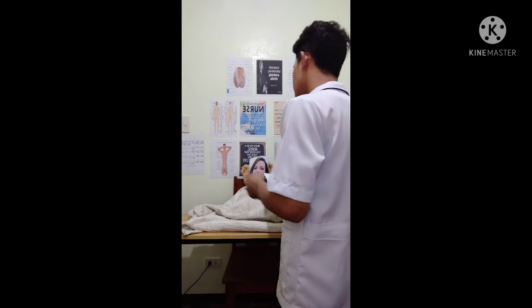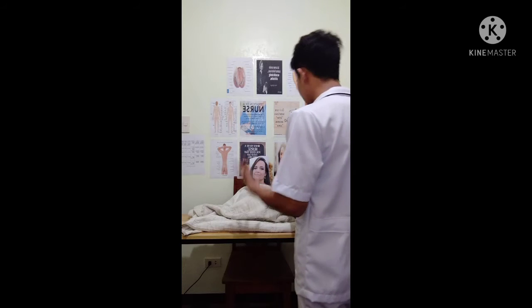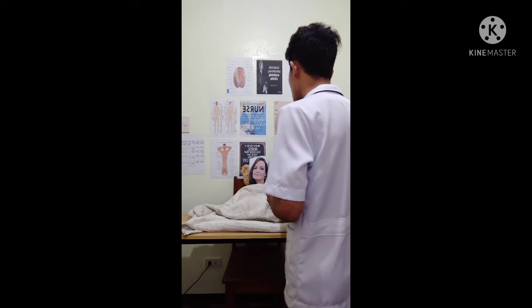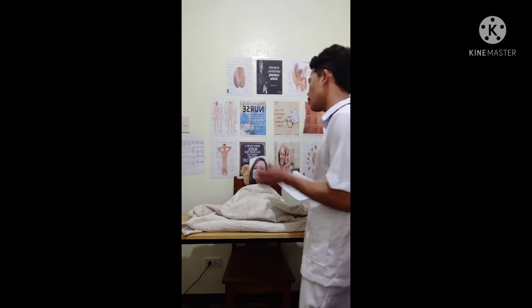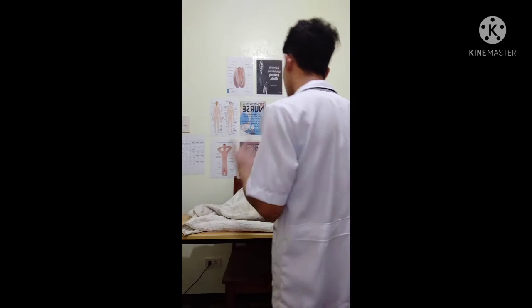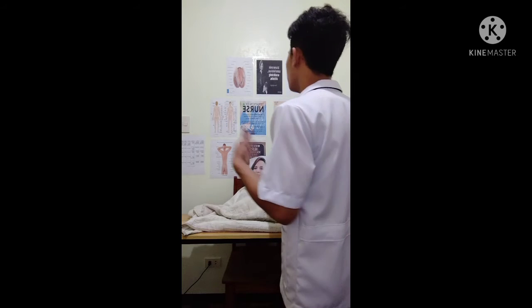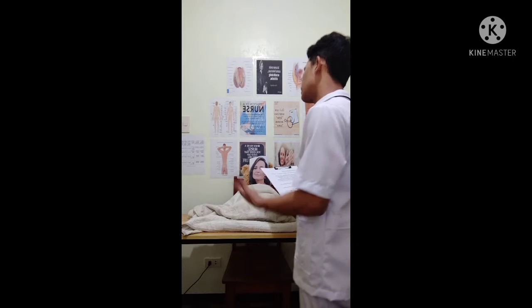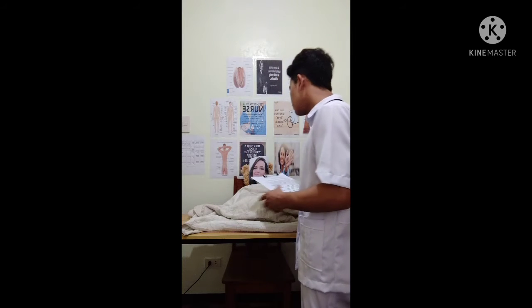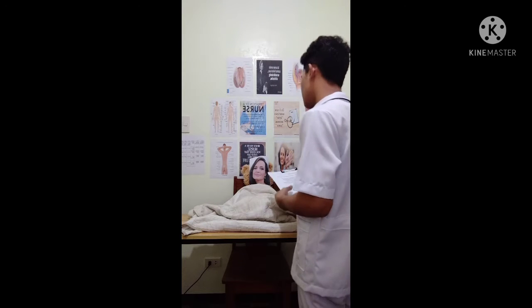So urinary catheterization, ma'am, I'm going to insert a tube in your bladder. This is to drain your urine freely, ma'am. So don't worry, rest assured that upon doing this procedure, we will provide the right care for you po. Do you have any clarification or do you have any concern, ma'am? Okay, ma'am. Thank you, ma'am.